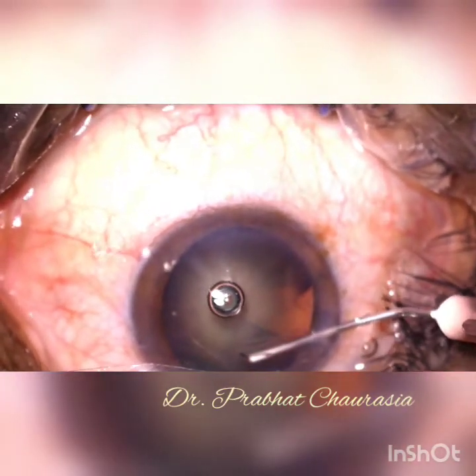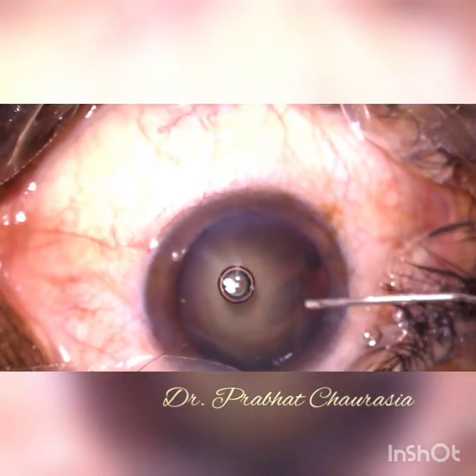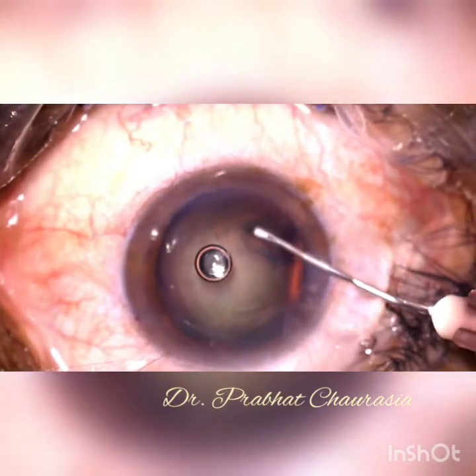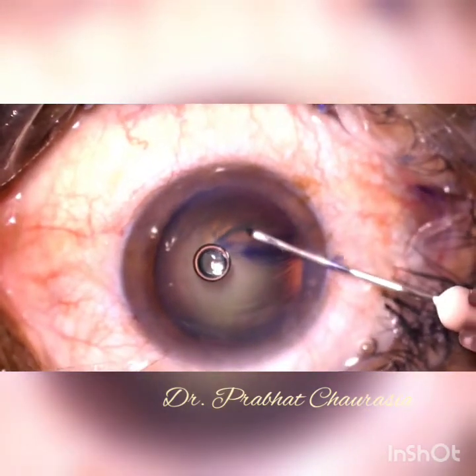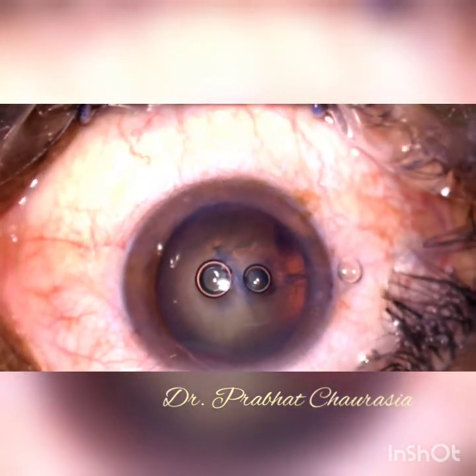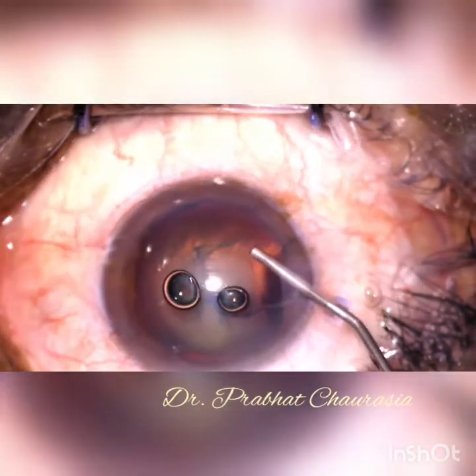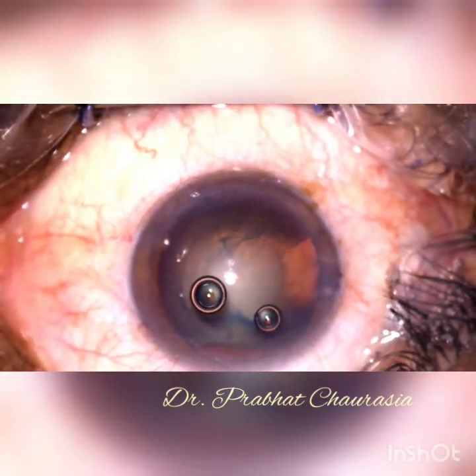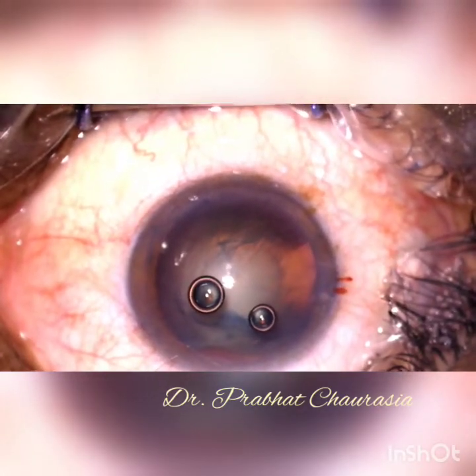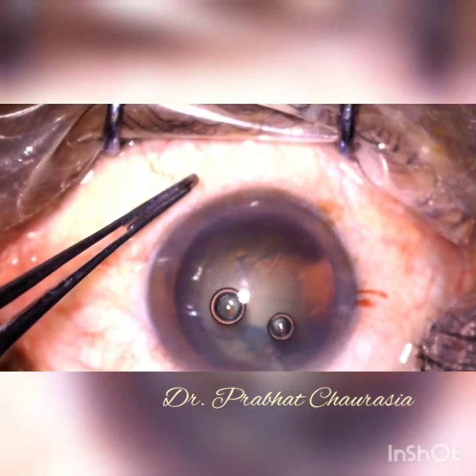This is a totally unedited video. See how much time I am taking to make this rhexis. Now, this rhexis is completed. Inject some 2% HPMC and then make a tri-planar main port by using a 2.8 steel keratome.